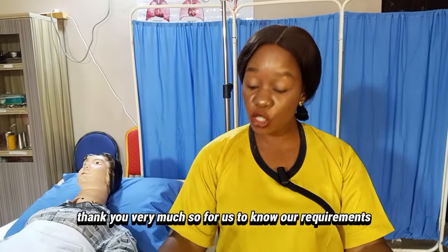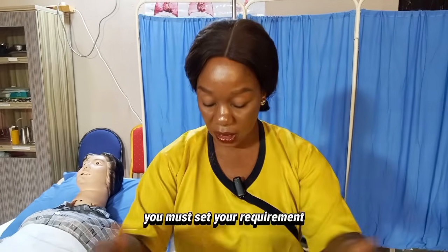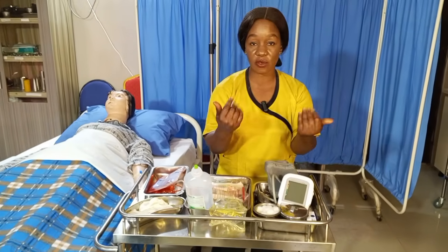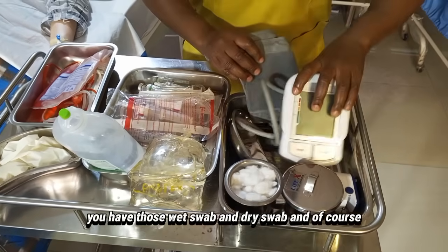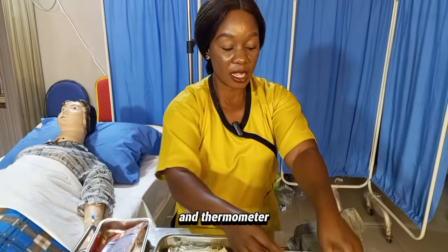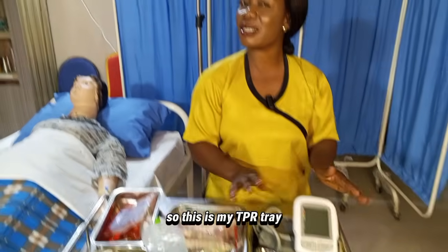For us to know our requirements — in nursing, if you are going to perform any procedure, you must set your requirements. These are my requirements. It's a trolley procedure. You must have a TPR tray. The TPR tray contains wet swab, dry swab, your BP apparatus, pulse oximeter, and thermometer. My TPR tray is set, along with a kidney dish for your swabs.